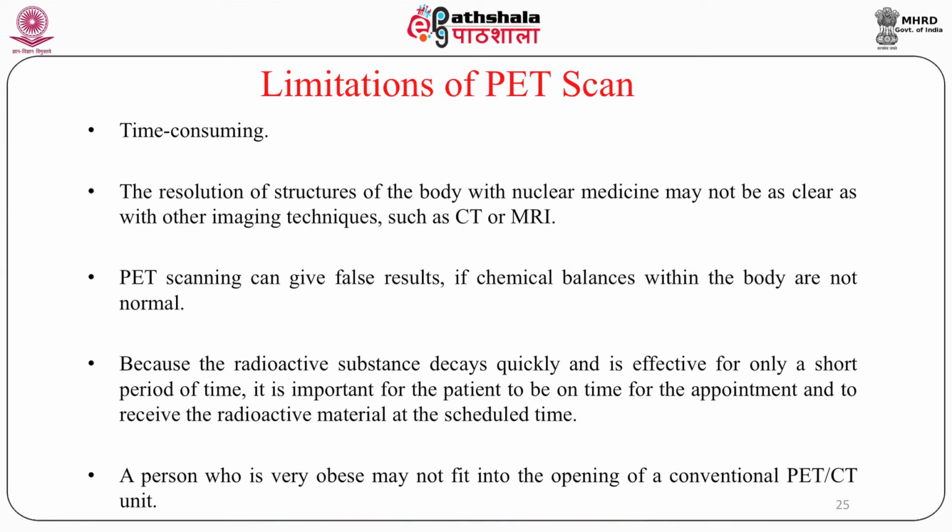Because the radioactive substance decays quickly and is effective for only a short period of time, it is important for the patient to be on time for the appointment and to receive the radioactive material at the scheduled time. The reason: the patient has to be there.